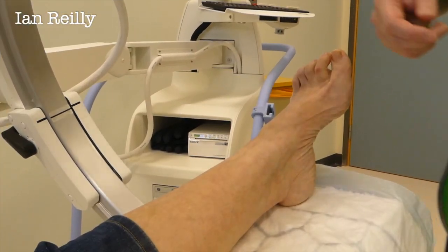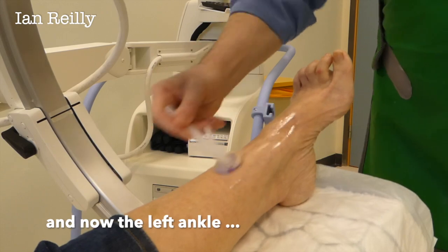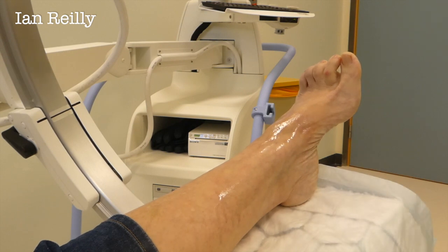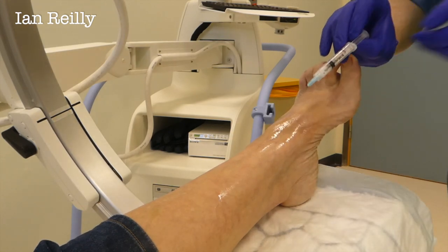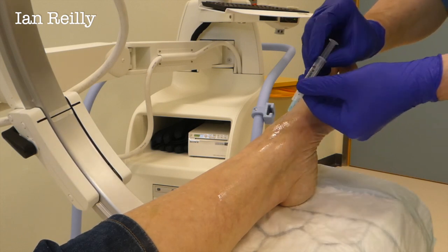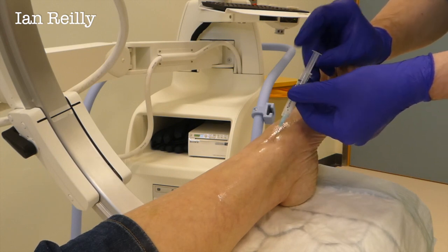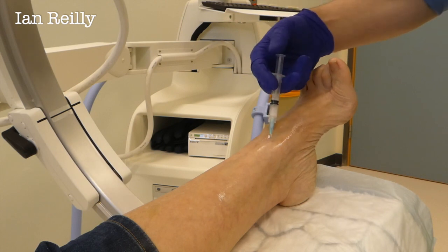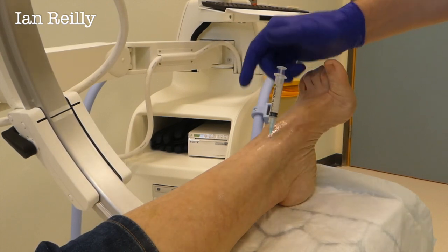Two for the price of one. This time I'm going to clean the skin first — no extra charge. We normally like to mark up the skin so we know where we're at. This is not my first rodeo. Then scratch — three, two, one — straight in. So that's really just showing off with the camera there, Pat.